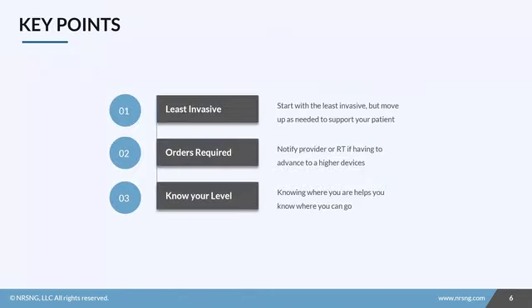So just to recap, we always start with the least invasive device and we work our way up as needed to support our patient, depending on what their needs are. We know that by monitoring their SpO2, right? Make sure that you're collaborating with your provider or your respiratory therapist, especially if you're having to advance to higher devices and if your patient's oxygen requirements are going up. And then finally, be sure to know where you are when it comes to FiO2.